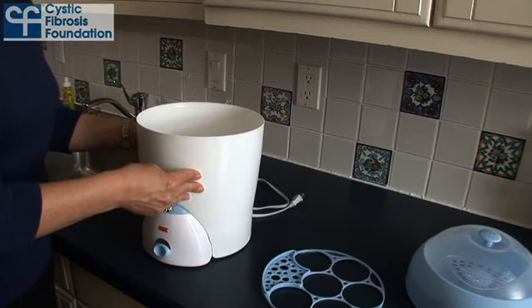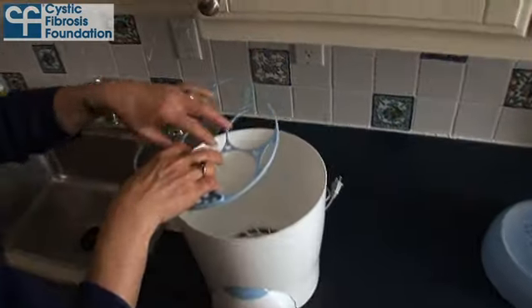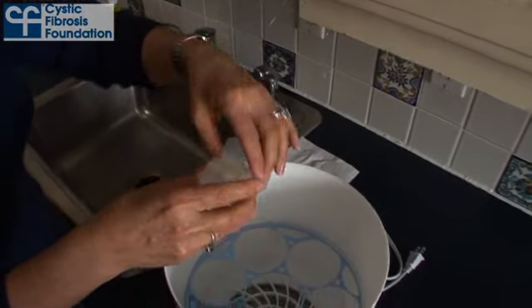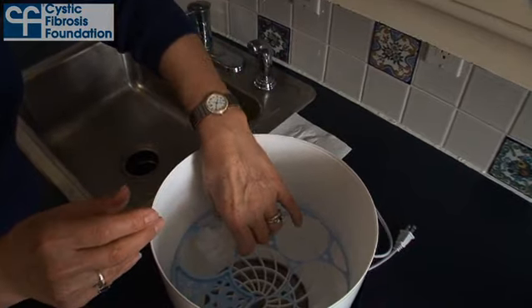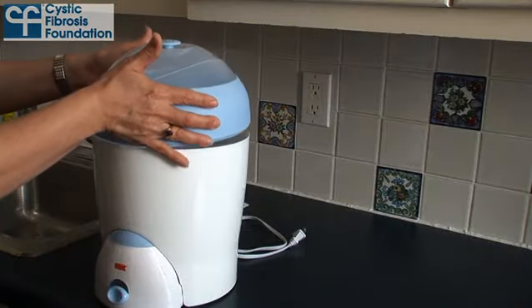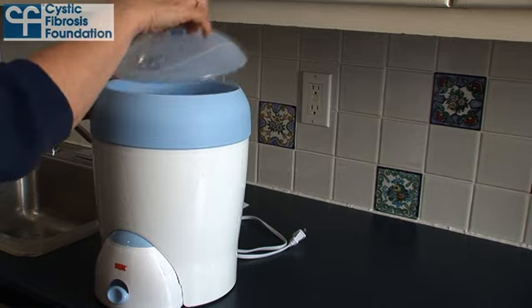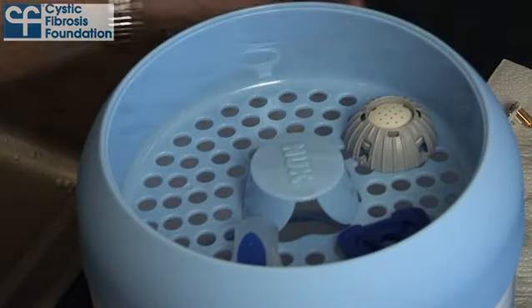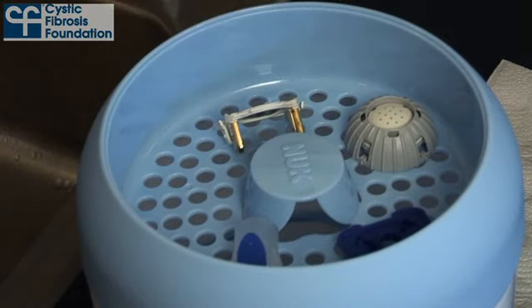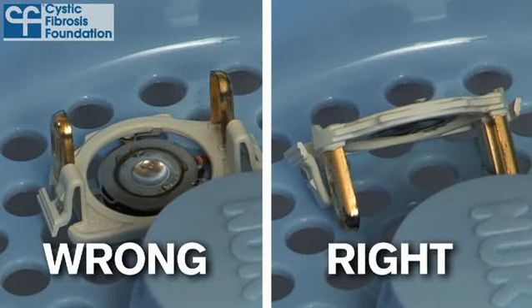Next, place the steam receptacle on the base and place the bottle holder in the steam receptacle. Use the hinge between the medication reservoir and aerosol chamber to hang the nebulizer handset over the bottle holder. This will allow you to disinfect multiple handsets during one cycle of the steam sterilizer. Place the accessories basket on top of the steam receptacle and lay the mouthpiece, medication cap, inspiratory valve, and aerosol head in a single layer. Be sure to rest the aerosol head on the plastic tabs and not face down.